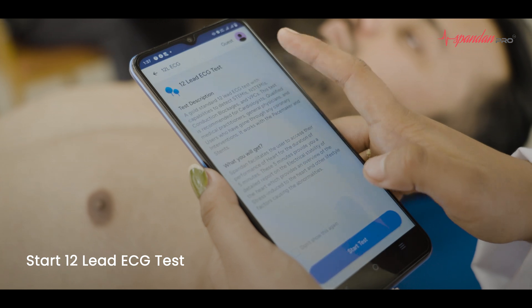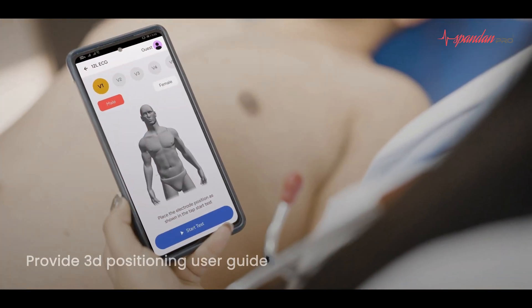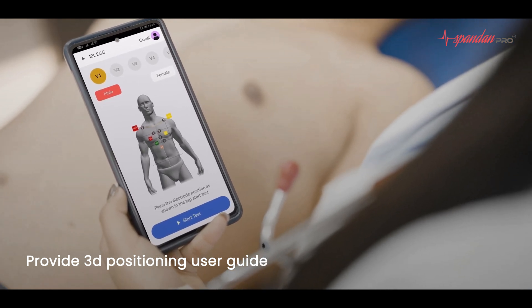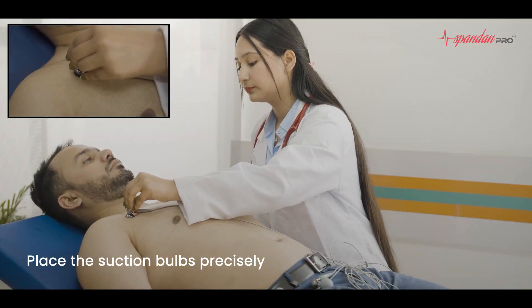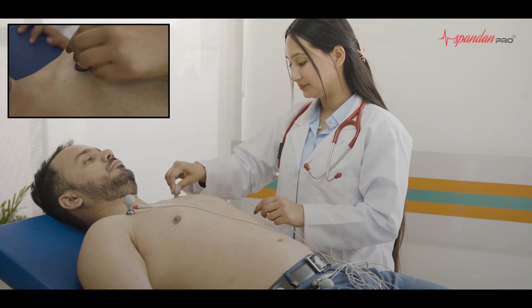Select the 12 Lead ECG test and tap on Start Test. You will see the electrode positioning on the screen. Start positioning the suction bulbs according to the instructions in the Spandhan ECG application.